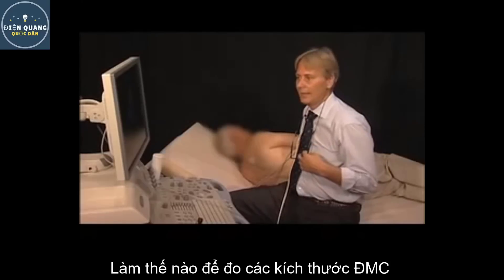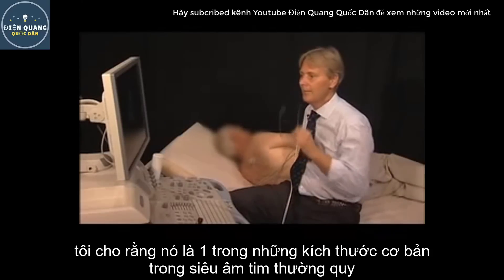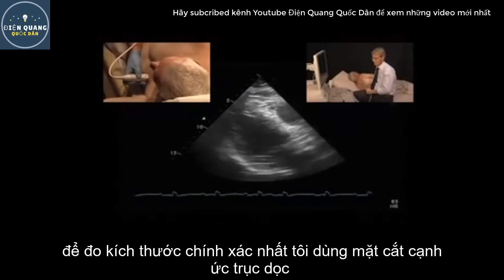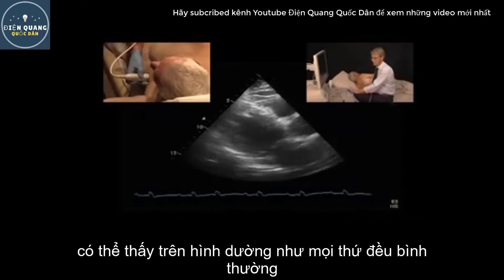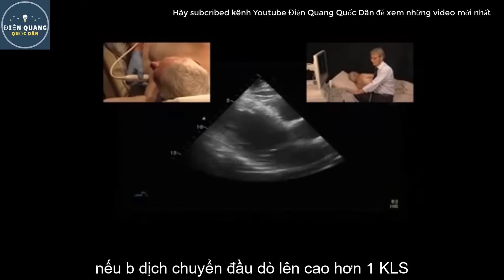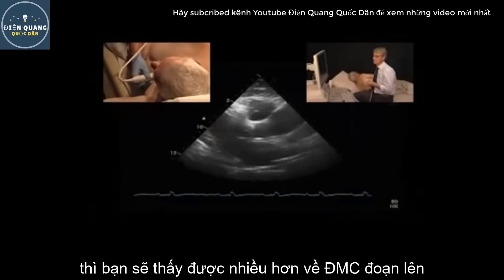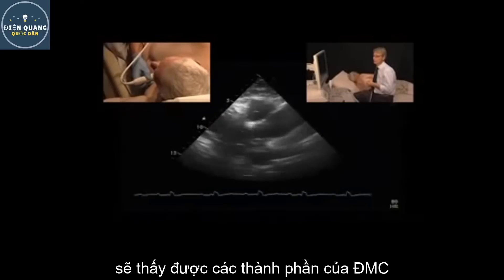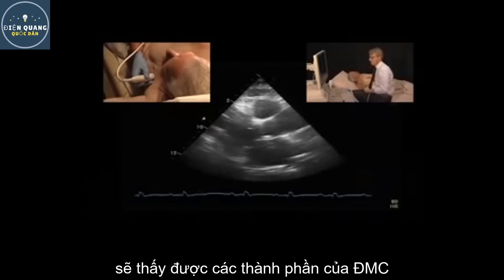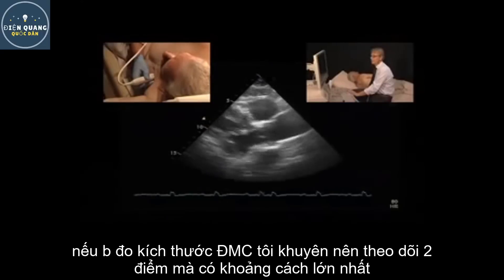How do we actually measure the size of the aorta? It should be an integral part of every exam. To really get a good measurement, we have to modify the classical parasternal long axis view. In the normal long axis view you would probably assume the aorta is normal. However, if you move the transducer up one intercostal space, all of a sudden you will see much more of the aorta — we see the cranial portions of the aorta.